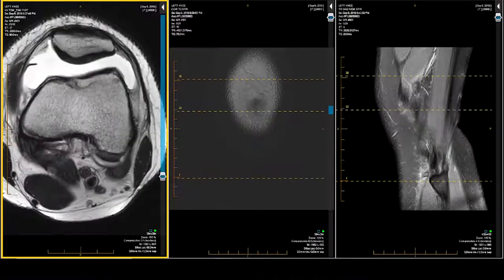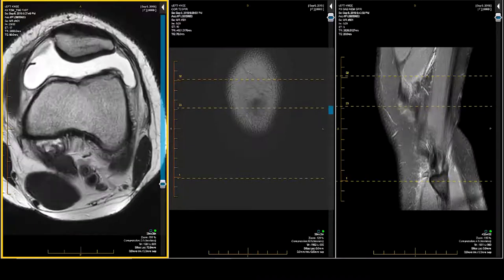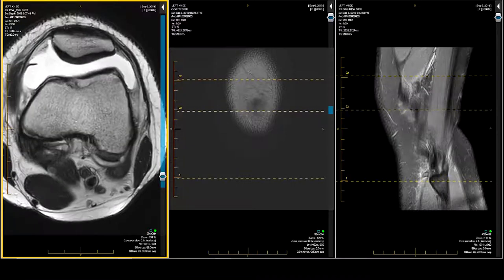If I'm after patellofemoral disease, I prefer an axial gradient echo with fat suppression. Very often I'll use a T1 gradient echo with fat suppression. But for my garden-variety knee, high-quality, high-resolution, T2-weighted imaging is just fine.